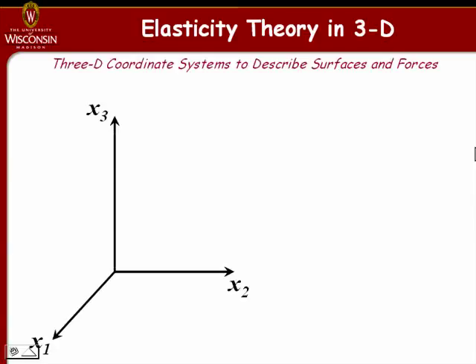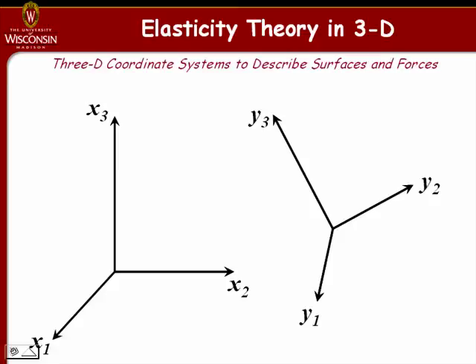If we want to extend that idea to 3 dimensions, it gets a little more complicated, but it's not too bad. The basic idea is that we want to first describe a 3-dimensional object. To do that, we start out with a 3-dimensional coordinate system. And we define these coordinate systems at our convenience. We align them however we want, we shape them however we want, but to keep things simple, we'll stick with the coordinate system that we're used to, up, down, left, right, front, back, because that's the one that we live in and we're familiar with it.